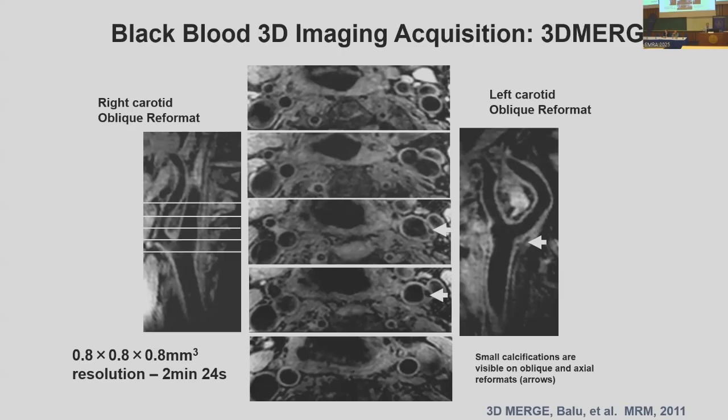So if you're able to put a patient on and off in 5 minutes, you can do many patients per hour. If you can do that, I think you can almost argue that MR is cheaper than ultrasound for screening carotids, because you can see beautifully where the artery is and the distribution of the lesion and so on.